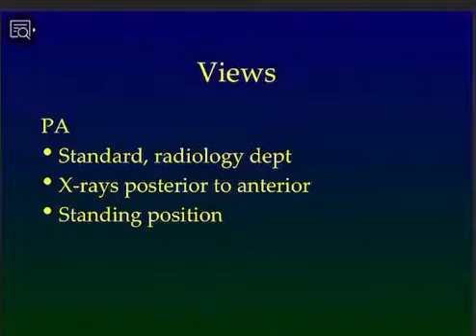And in this view, the X-rays pass from behind the patient. The patient is standing, like here there is a female technologist who is holding this X-ray tube. X-rays are passing from this X-ray tube and they are forming an image in front of the patient. So in that way they are postero-anterior, right?